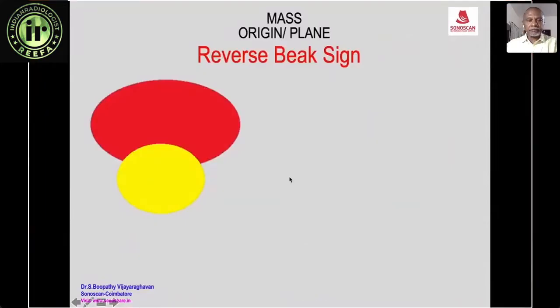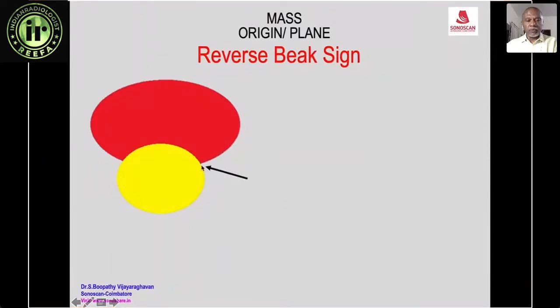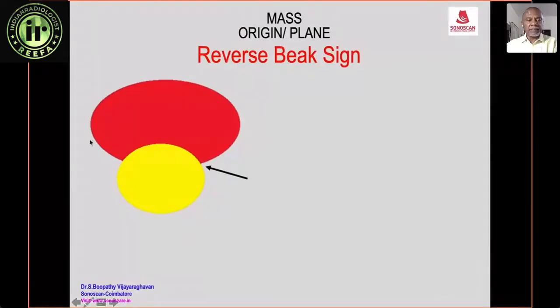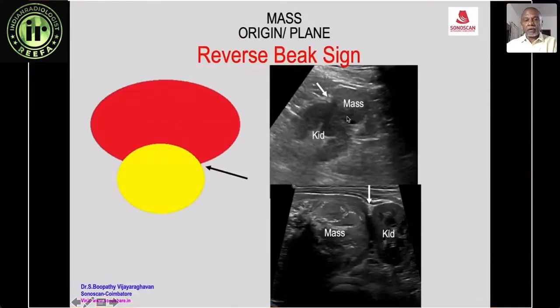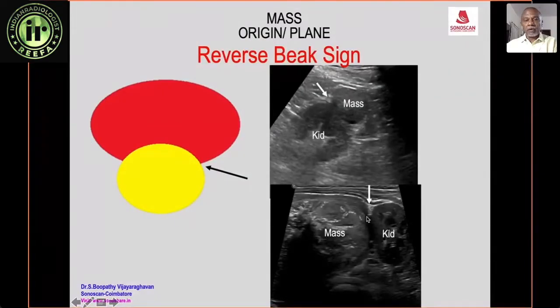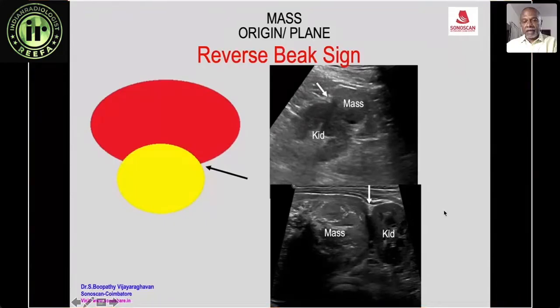The reverse beak sign: the organ and mass are seen together, but a groove is visible between them. This suggests the mass is not arising from the organ — they are close but the mass has a separate origin. An example is a ganglioneuroma of the retroperitoneum anterior to the kidney showing the reverse beak sign.